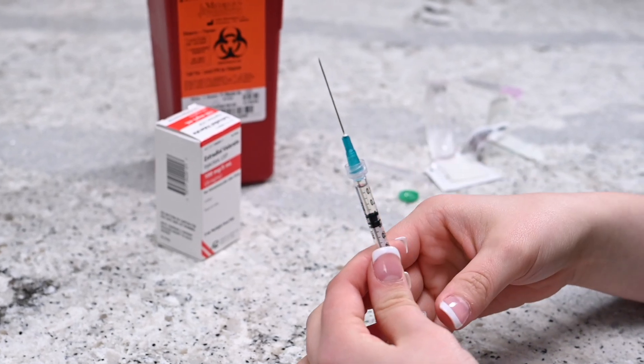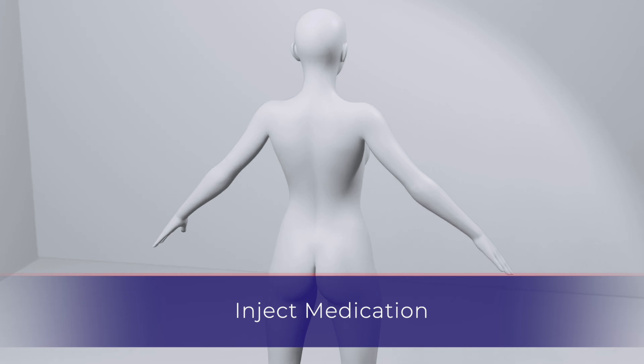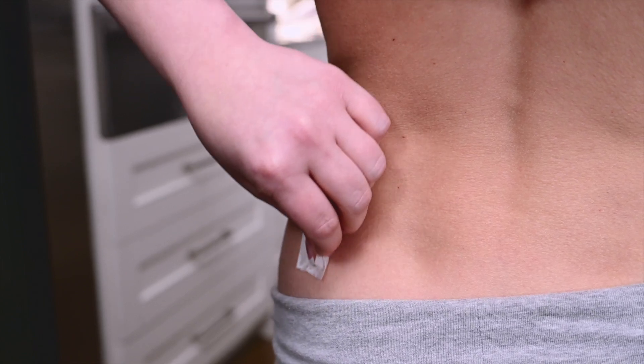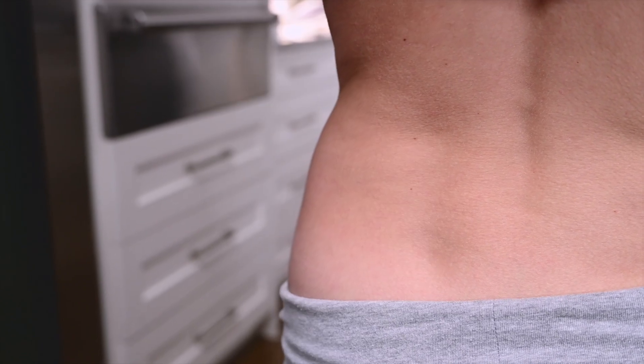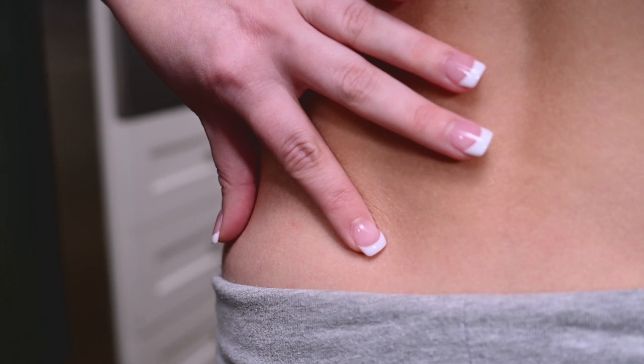The injection should be given in an intramuscular site specified by your physician. Wipe the injection site with an alcohol prep wipe and allow the skin to dry. Make sure to alternate the injection sites between both sides of your body. Take your syringe in your preferred hand and stretch the skin between your fingers at the injection site.